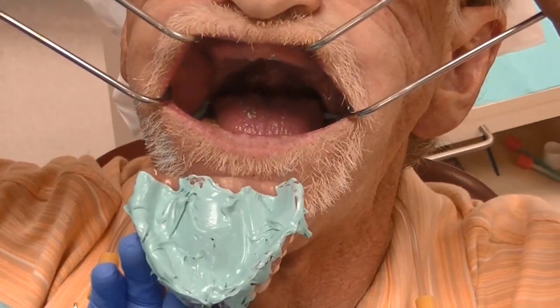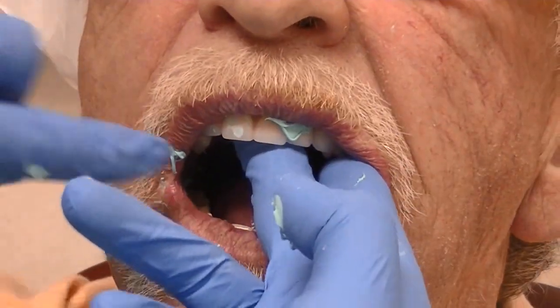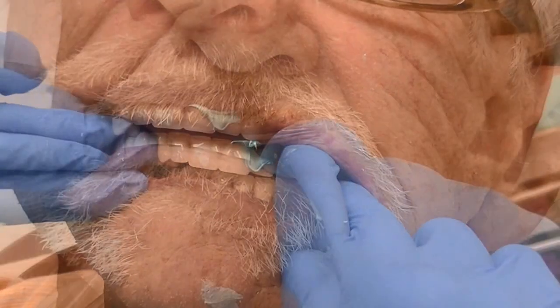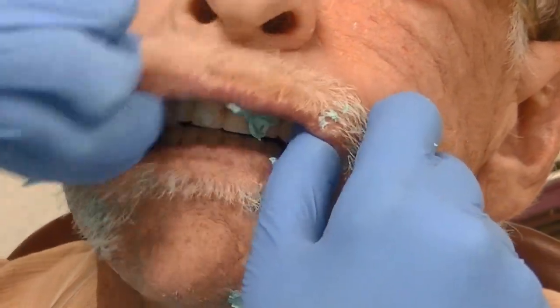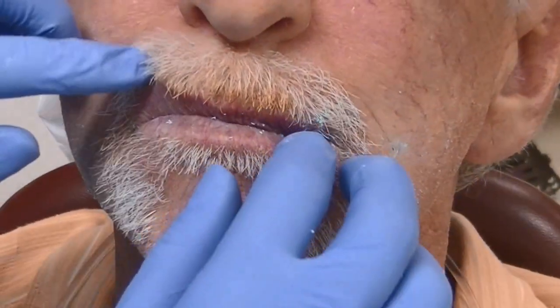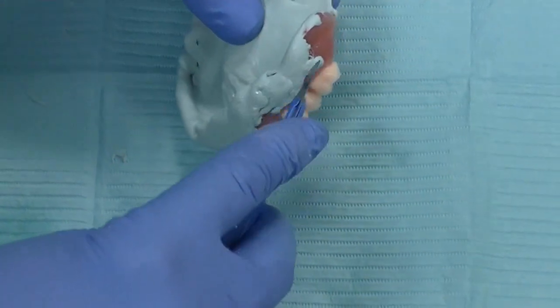With the patient using a couple of cheek retractors to make the task easy, we seat the denture onto the maxillary ridge with a moderate amount of pressure. Removing the cheek clips, we have the patient carefully close back into a centric position and do border molding motions as normal. Tugging on the cheeks and lips verifies that we have a relatively decent reline-style impression for this technique. After complete polymerization, when material is fully set, we remove the maxillary prosthesis and, just like the mandibular, lightly trim around the peripheries ensuring the border remains intact.